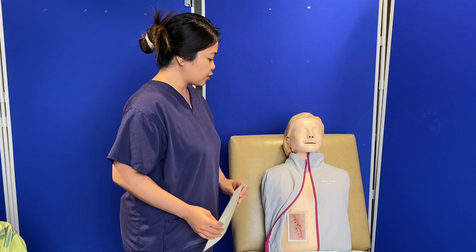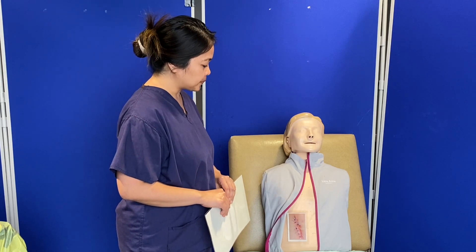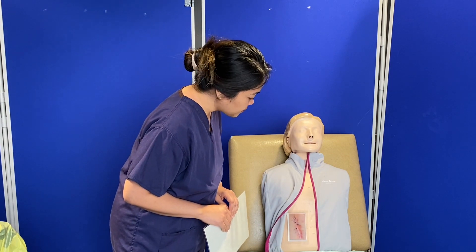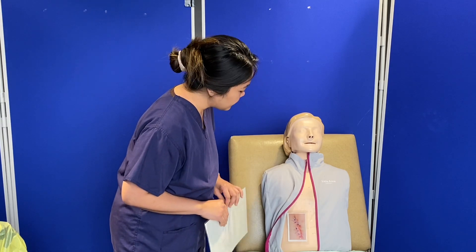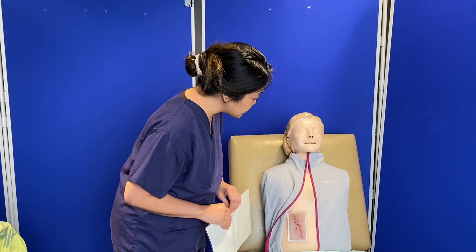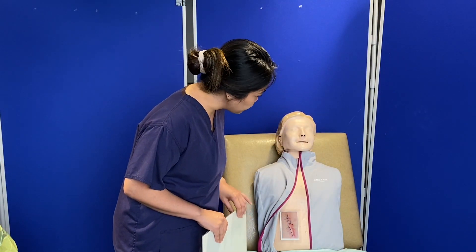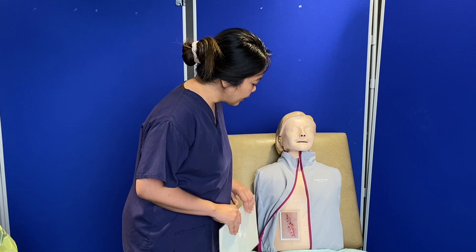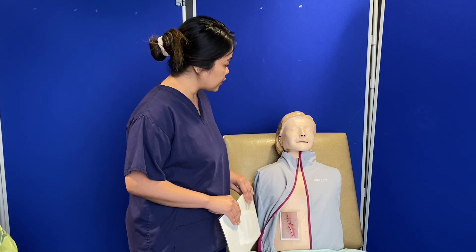Thank you for exposing the surgical wound. I need to do some assessment before I do the wound dressing. I can see that there is erythema on the lower part of the wound. The area around the wound is dry and clean with no presence of exudate. I can see seven blue sutures as wound closure. At the bottom, there is good granulation and good wound healing. Do you have any pain or tenderness on the surgical site? No, I'm okay. Thank you.